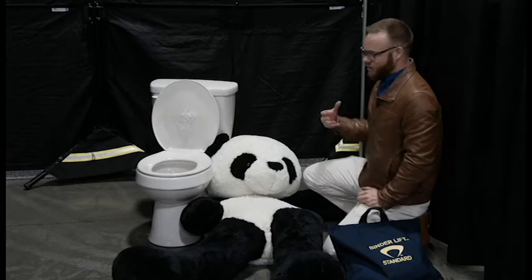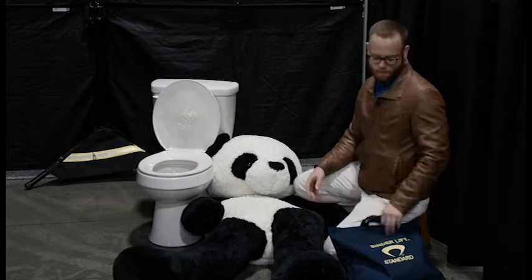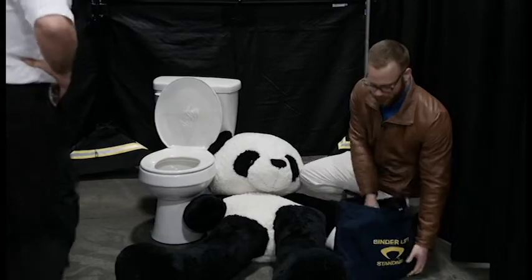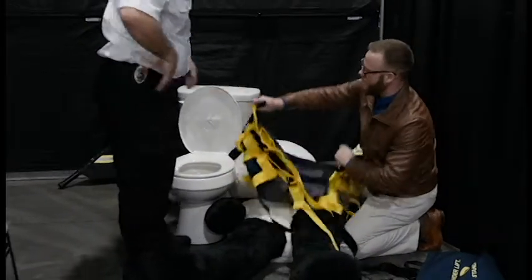So instead of using a sheet or improvising in some other way by grabbing the patient's limbs, I have the Binder Lift with me and my friend Eddie, who's going to help me pick this panda up. Now this panda is filled with sand, so it weighs approximately 150 pounds.